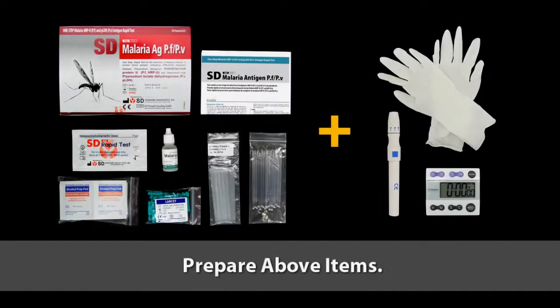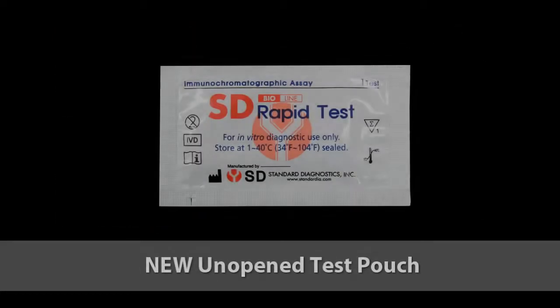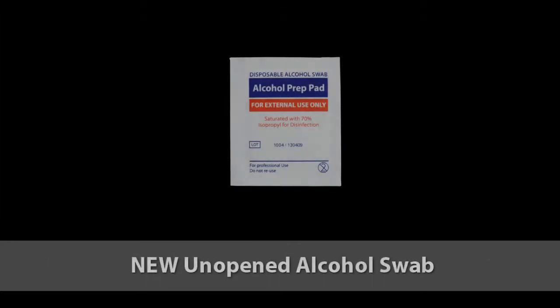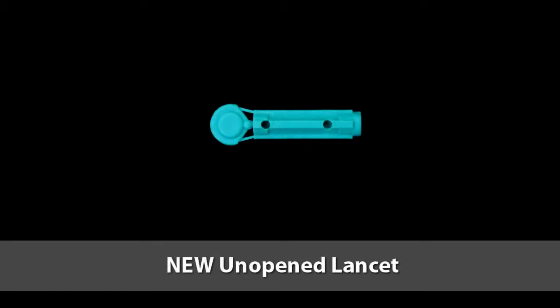These materials should be prepared before starting the test: a new unopened test pouch, a new disposable inverted cup or capillary pipette, a new unopened alcohol swab, and a new unopened lancet.